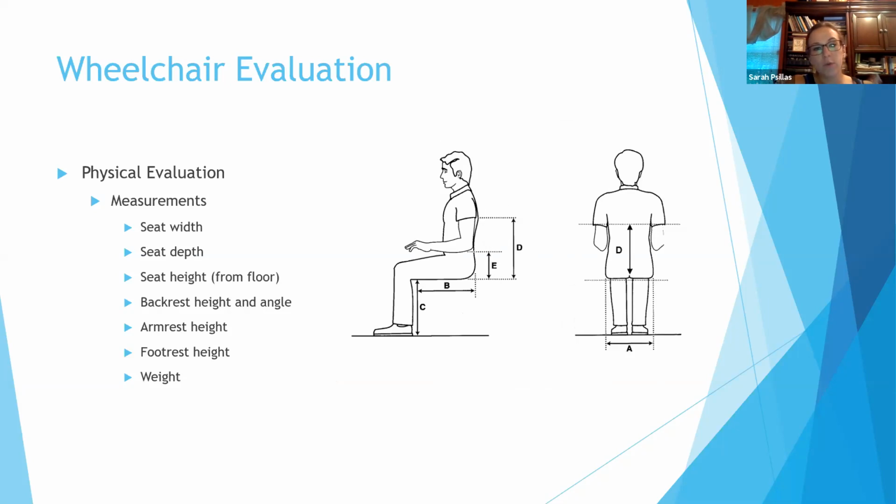These are specific wheelchair measurements, and if you would like more information on this, I can provide that to Kate, and she can get that information to you. But essentially, these are the different areas you want to measure when you're measuring for a wheelchair. So these will help you make selections if available. And so again, I can give that actual document to her if you're interested.